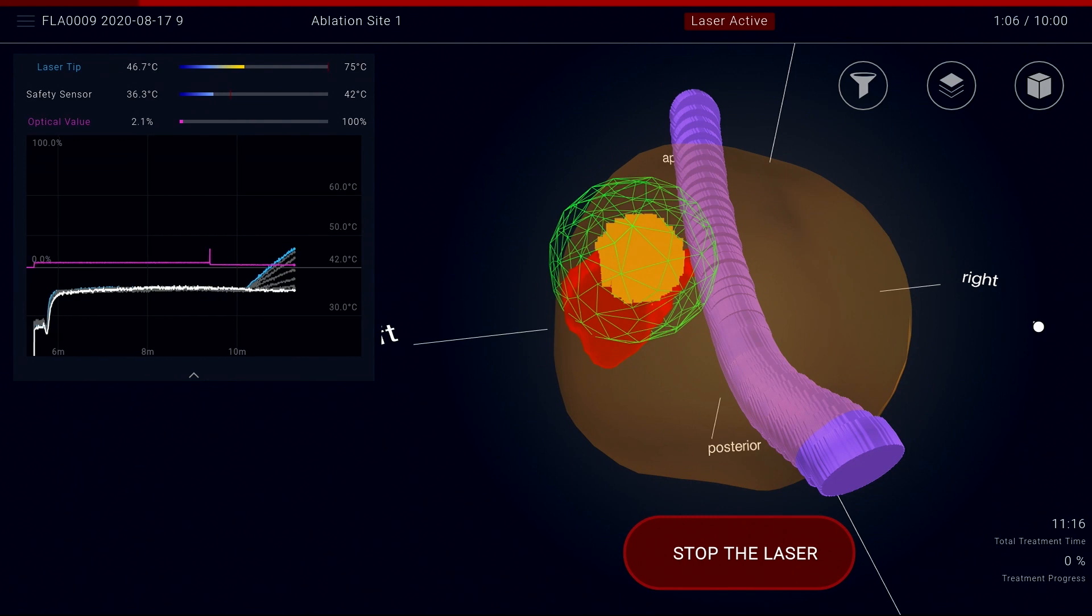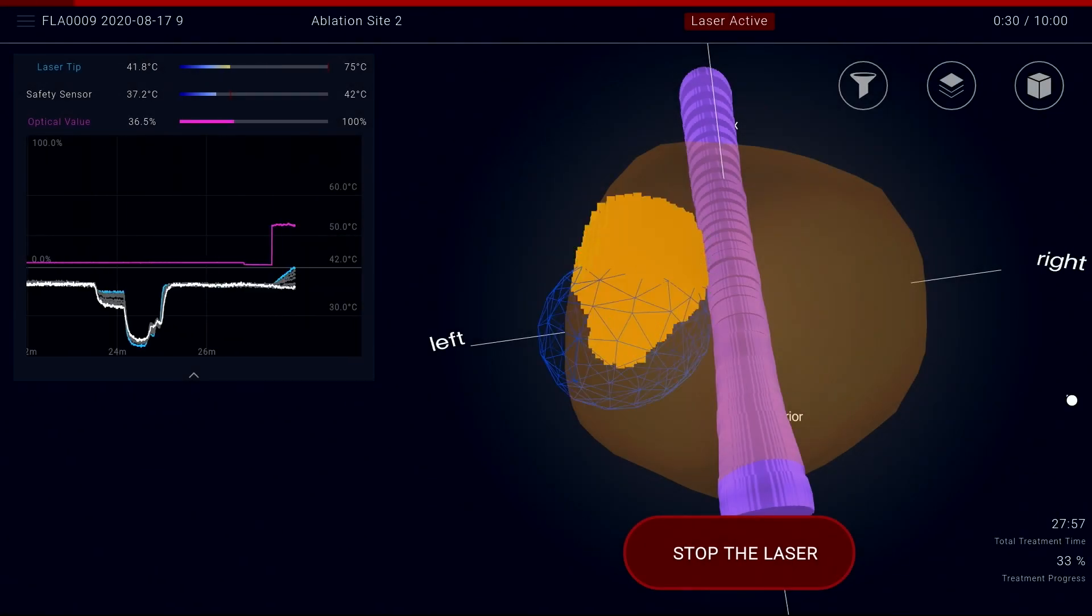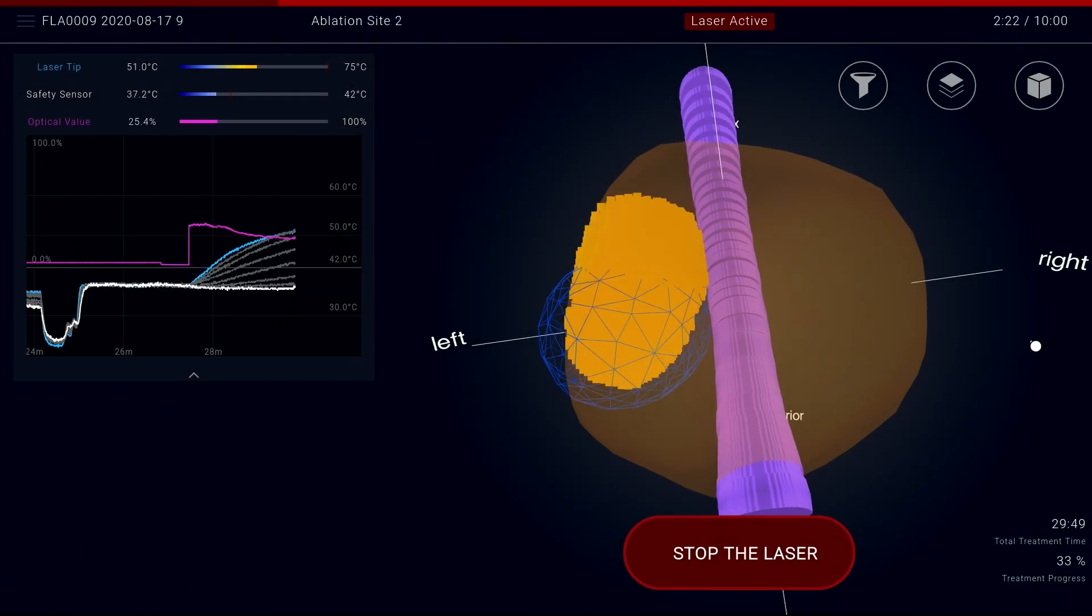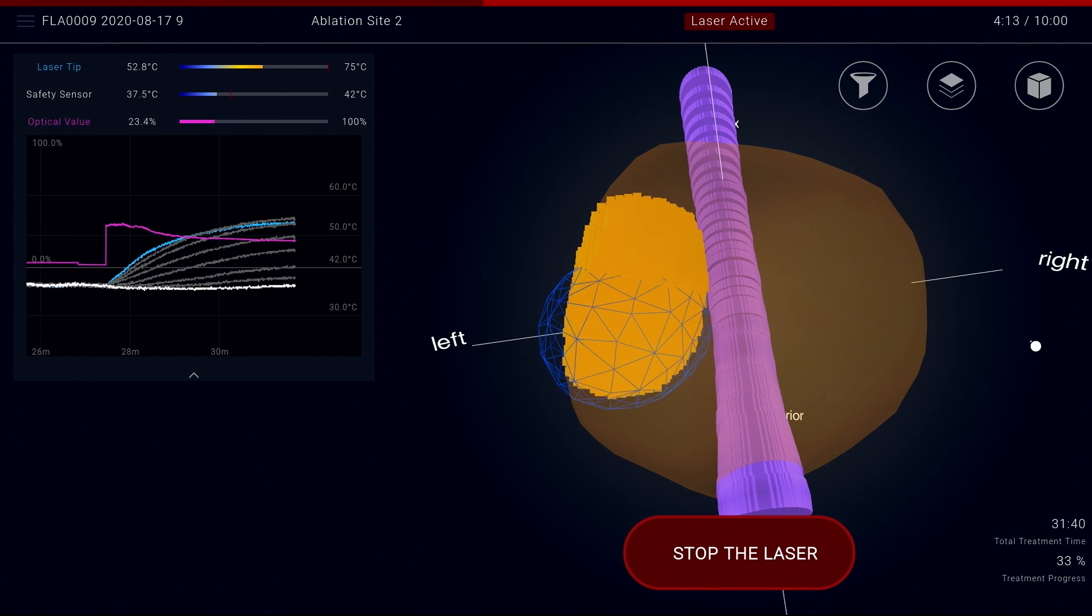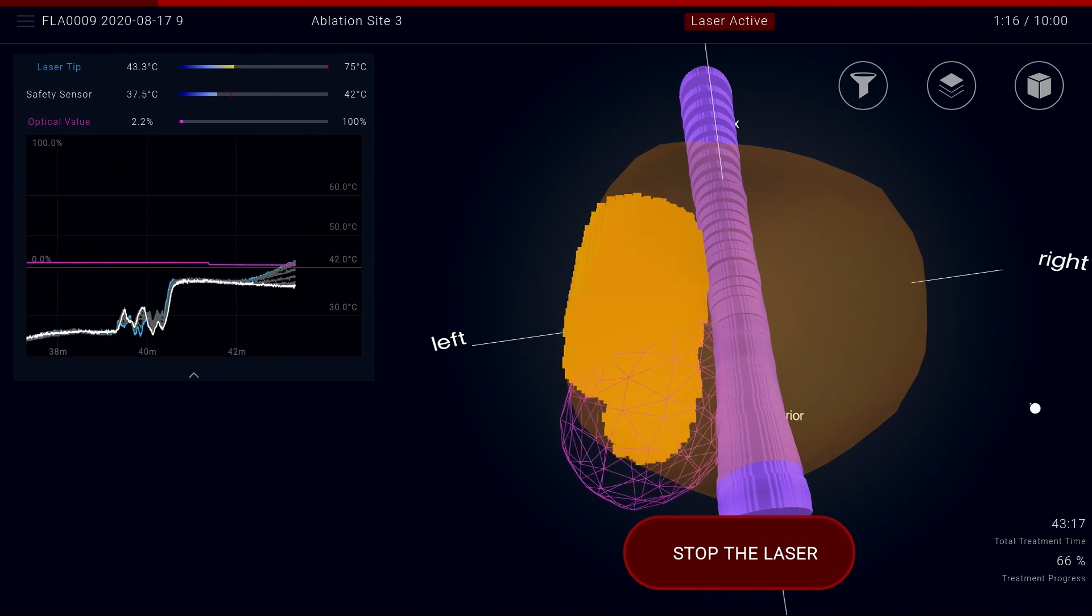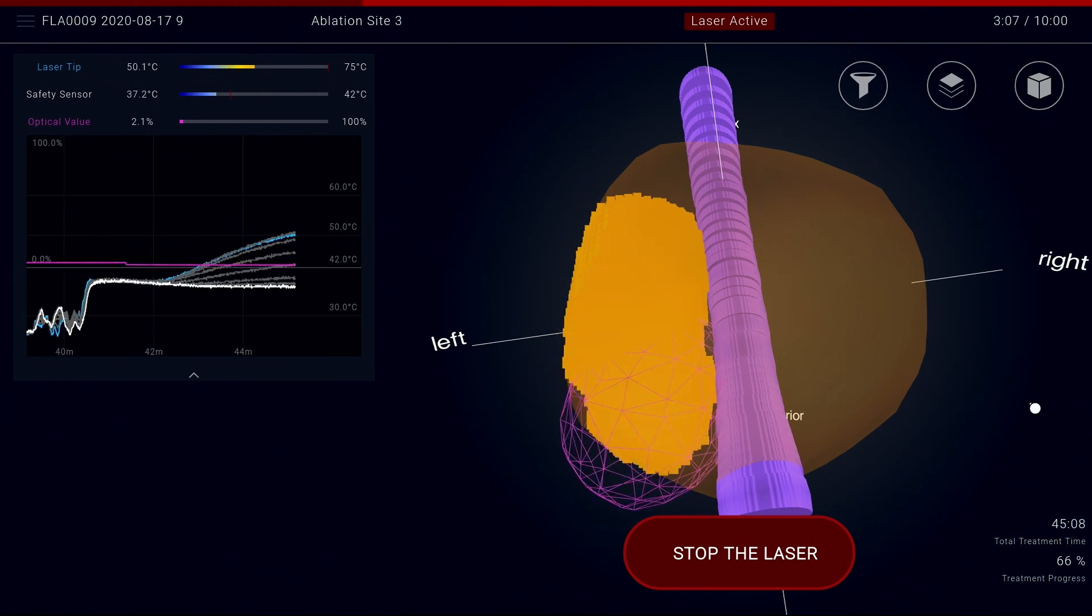A damage map based on the Arrhenius equation uses time and temperature data collected from the thermal probe to visually estimate the progression of ablated tissue. This damage map will display as yellow pixels which progressively fill the ablation outline. With each treatment location, the damage map is expanded to fill the treatment plan.